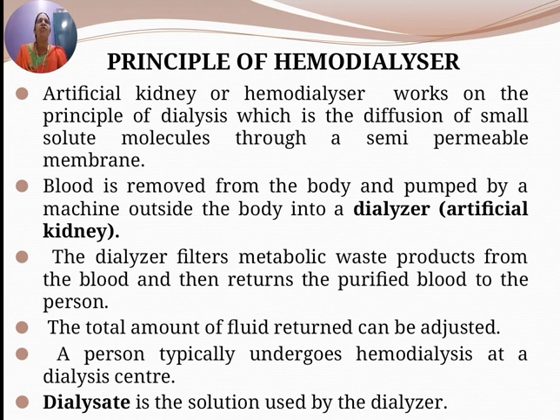Blood is removed from the body and pumped by a machine outside the body into a dialyzer. So it is called an artificial kidney.